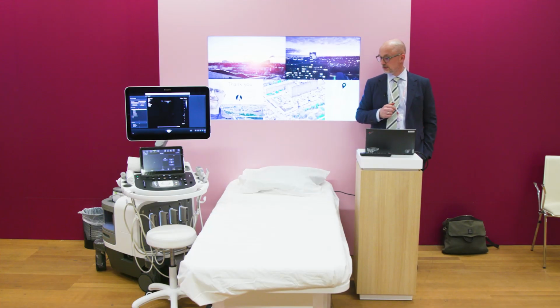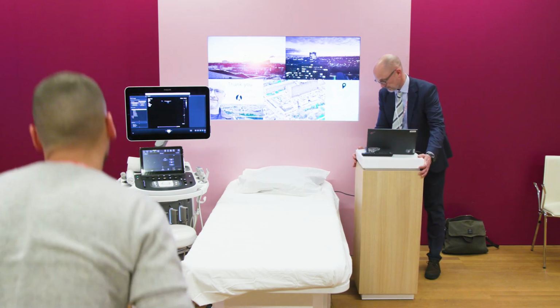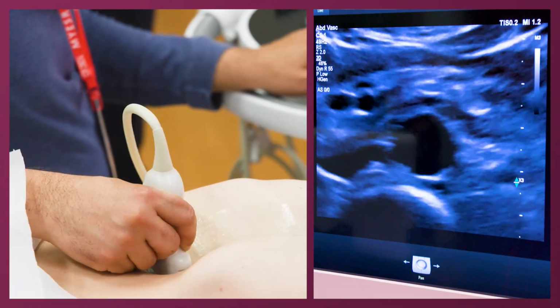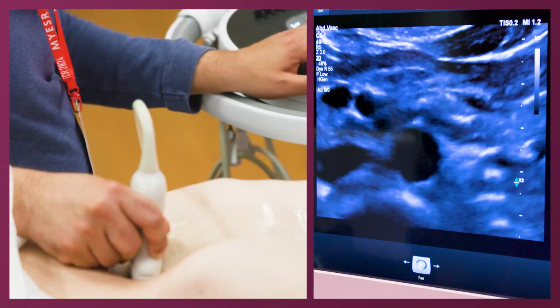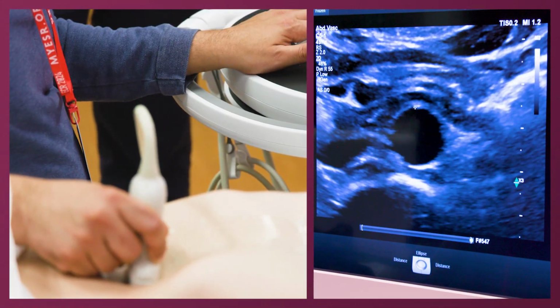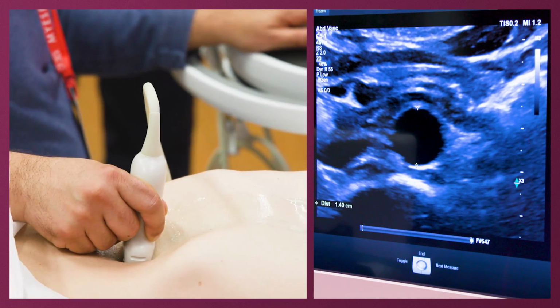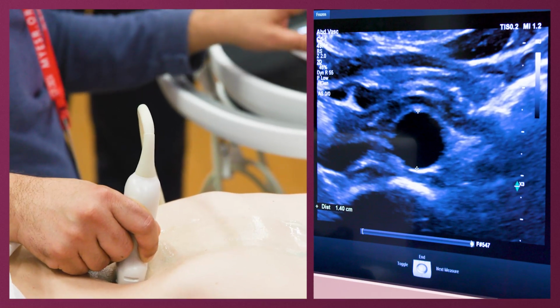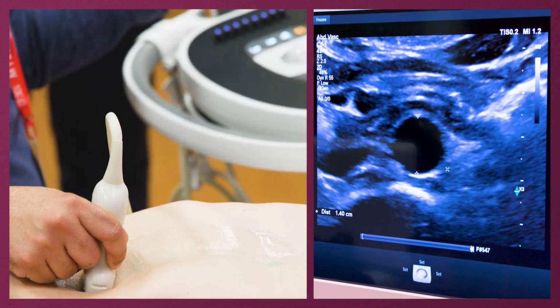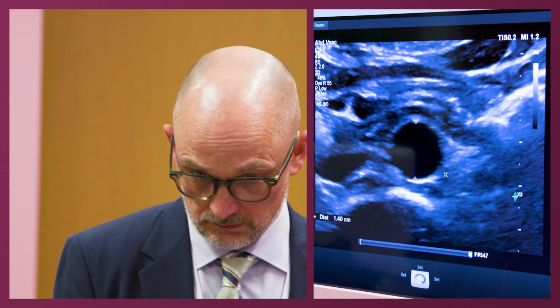I think you should spread around the systems. Another discussion that we've had in Copenhagen is: should you measure in diastole or systole? You need to agree on that in the institution. And do it the same time every time. Yeah. We always measure in systole.